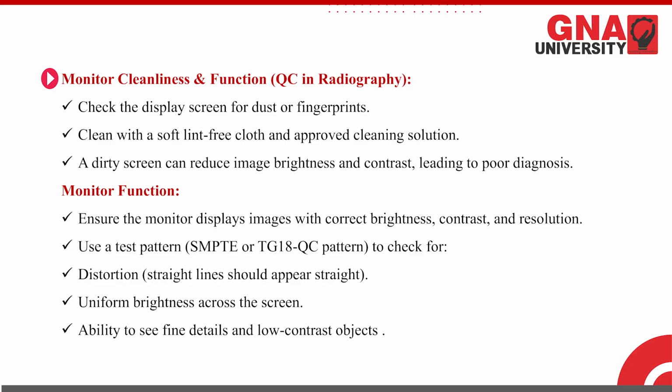What is this test pattern SMPTE? Simply, this is a special image with different grayscales and different structures: holes, lines, and different patterns. We display this image on the monitor, and it helps us recognize whether the display is showing the image properly, with proper colors and proper structures or not. So this is a special type of image, the SMPTE and TG18 QC pattern.